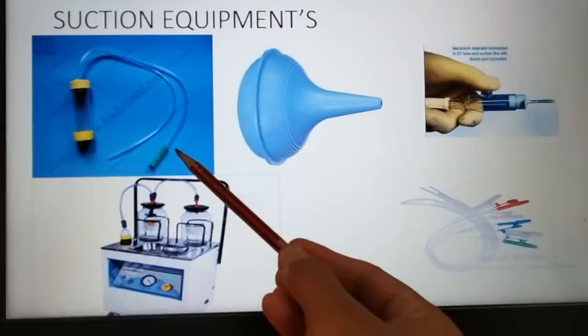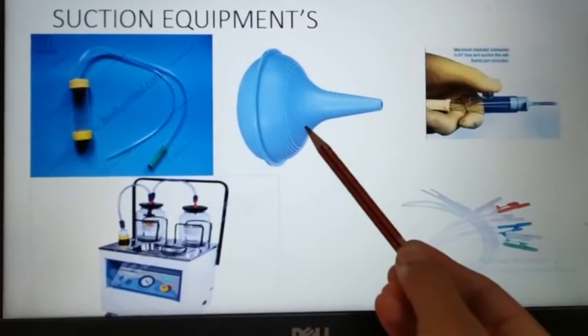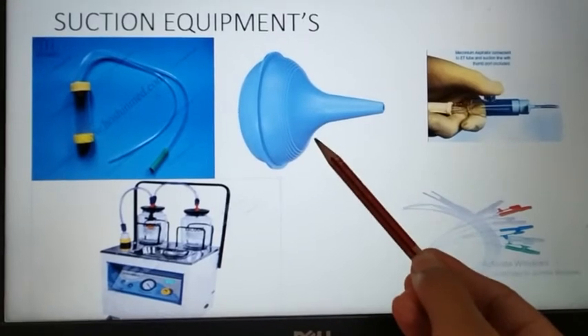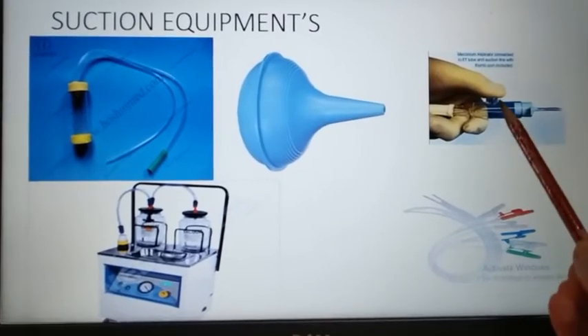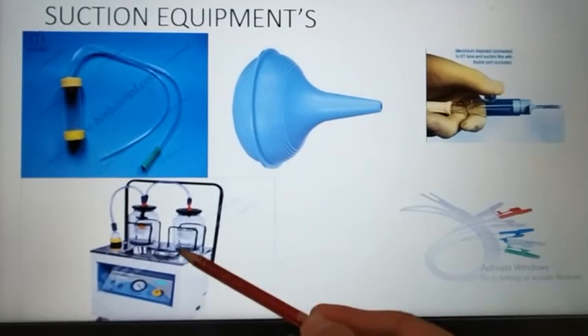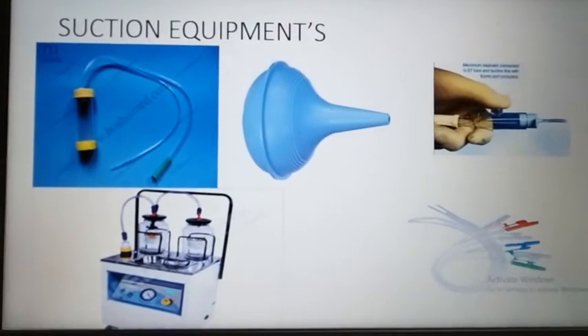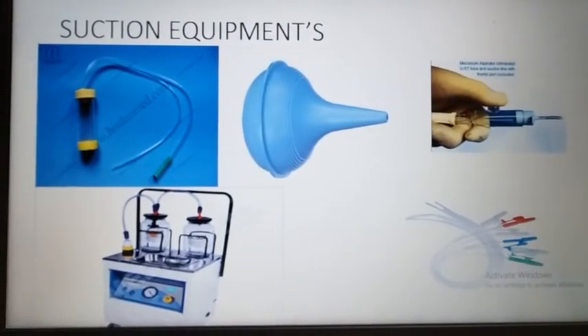This is mucous extractor or mucous aspirator. This is meconium aspirator, used for removal of thick secretions. This is also a mucous aspirator. This is a mechanical suction device, and these are the suction catheters of different sizes and colors.